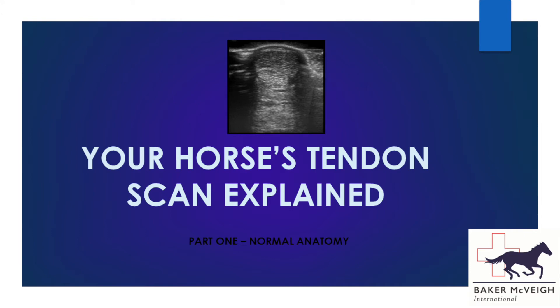Hi and welcome to the first of two short tutorials that I hope will help explain the images we obtain when we scan the tendons and ligaments on the back of the cannon region of a horse. The images we're going to be looking at are obtained from a front leg, but a hind leg is very similar.